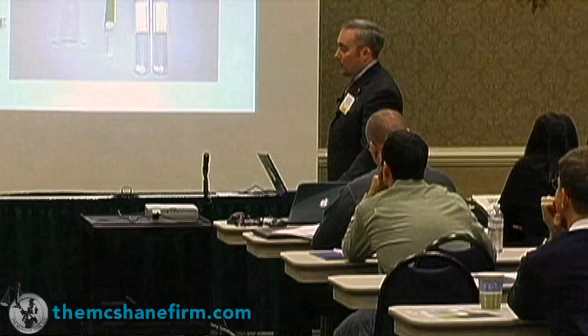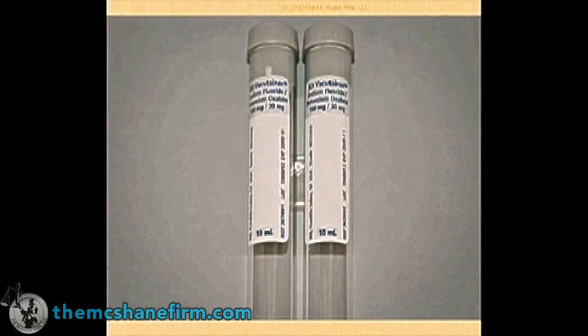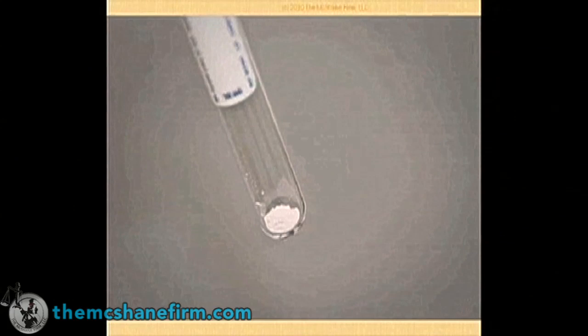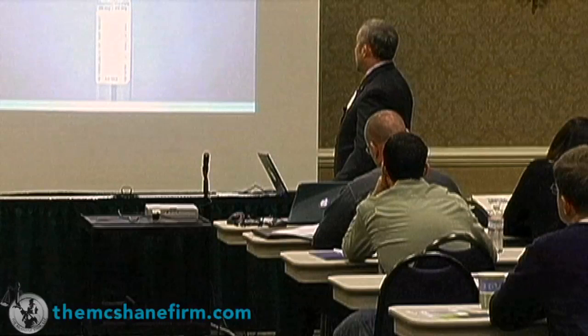Okay, buzzing right through, because not everyone has it in front of them, these are the two tubes that come in there. This is the sheath needle, and this is the hub. An exploded view or a closer view of the same exact things. As you can see at the bottom, you can see the additives that are there. You can visually see them. And you can, of course, see the label. This one says potassium oxalate, sodium fluoride. It says 100 milligrams. I think we have a better one. 100 milligrams, 10 milliliter draw. That means it has a 1% amount of sodium fluoride that's there. It's going to be important later on. So this is it at the bottom. To give it some scale, that's present.